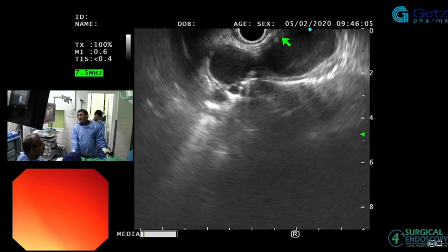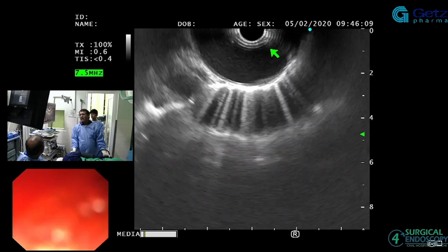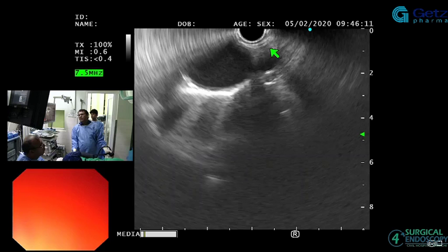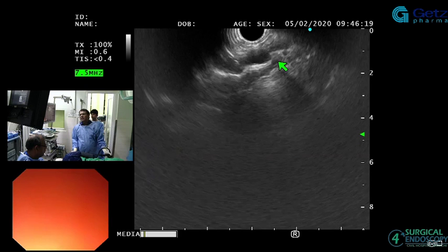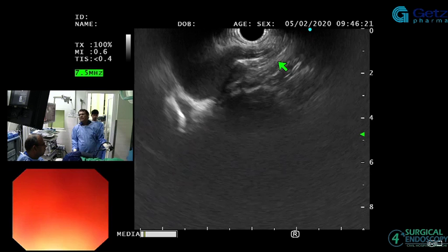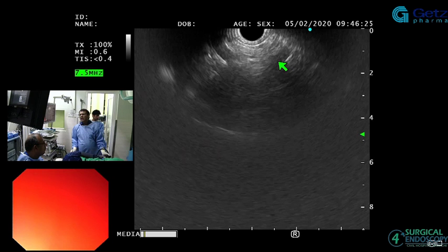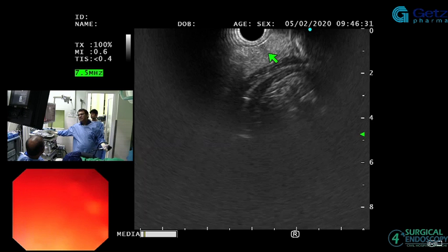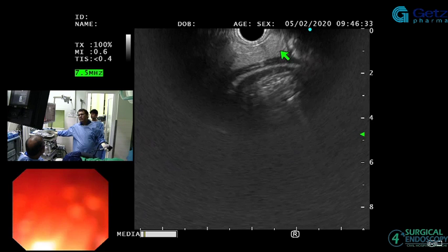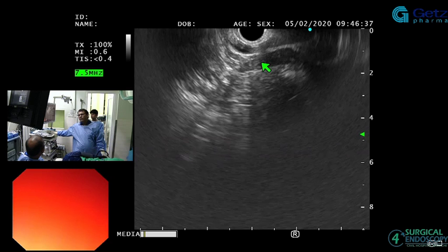Now from there, I can come back further. If I'm more interested, I can take a look at the left carotid. There's going to be the left subclavian here. I keep pulling back a little bit further. As I mentioned before, you likely see the thyroid gland better on the way in, but sometimes, oh, there is a nice, beautiful looking thyroid gland. You see that? Yes. And earlier I saw a jugular as well. That's pretty much it. I think we are done. Okay. Thank you, Khaled. Excellent.